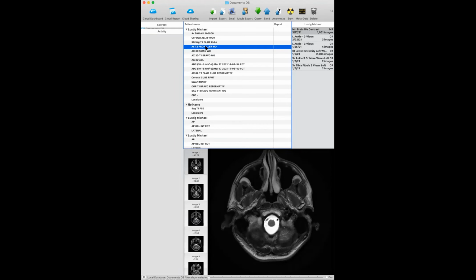This one is a T2 spin echo, but using what's called propeller. We'll talk about it some. Maybe I'll mention what propeller is, but at some other point. If I don't, please remind me. By the way, that could be another excellent project, propeller. And propeller is a kind of radial acquisition trajectory, a mix of radial and Cartesian. I'll mention it briefly.